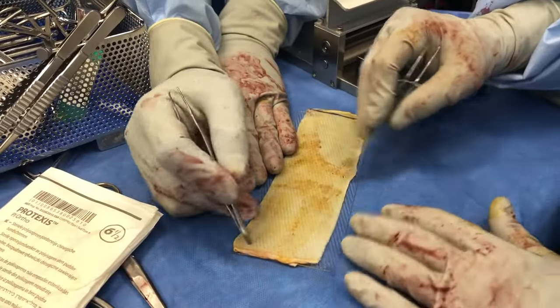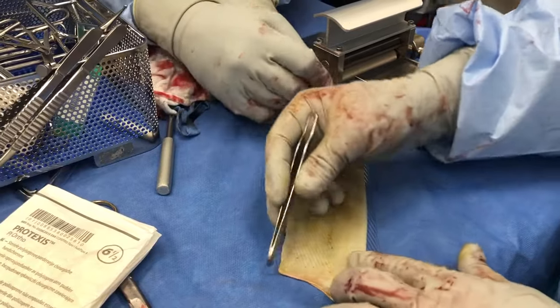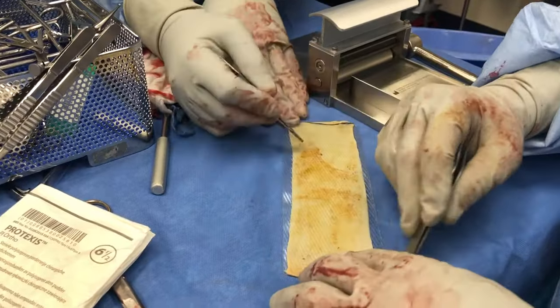The skin graft is ensured it is stretched out fully, as any wrinkling or rolling of this often can result in transection of certain parts of the graft.